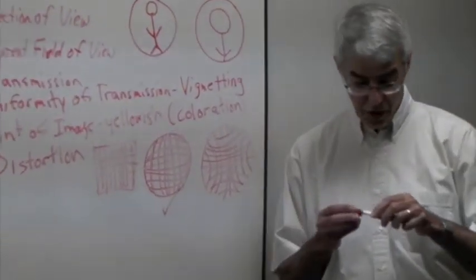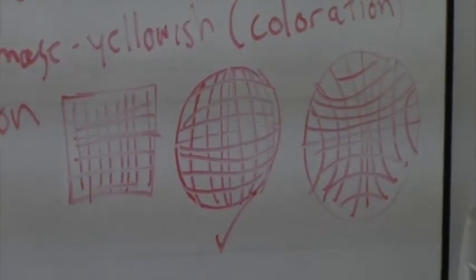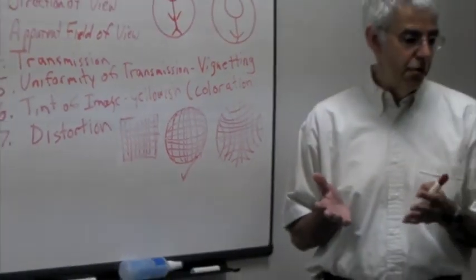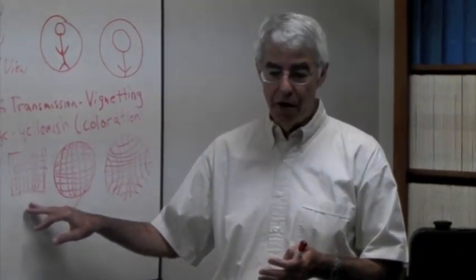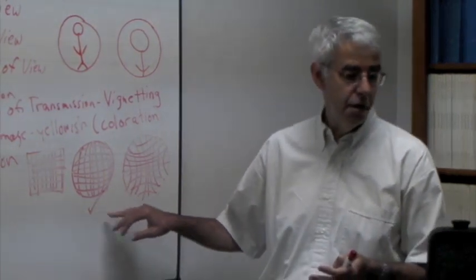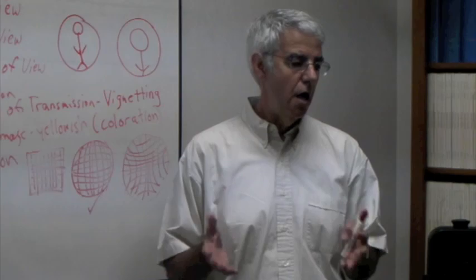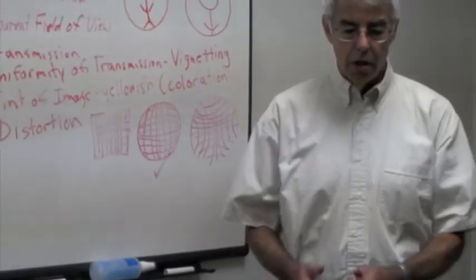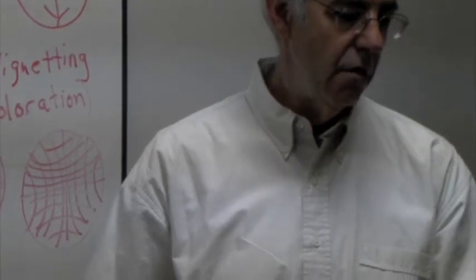So again, it's reasonable for a surgeon to expect that when they're looking at something with square features, it's going to be square in the image. Distortion is tolerated fairly well. So again, like I said, the distortion is fairly well tolerated.